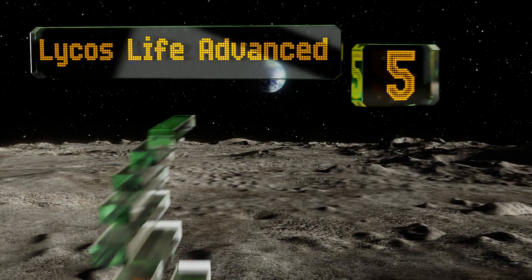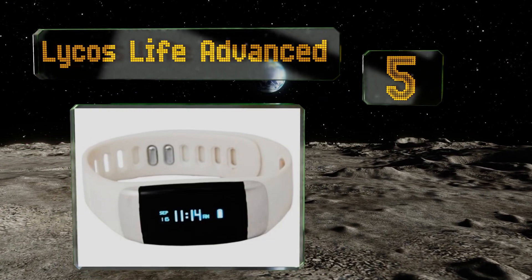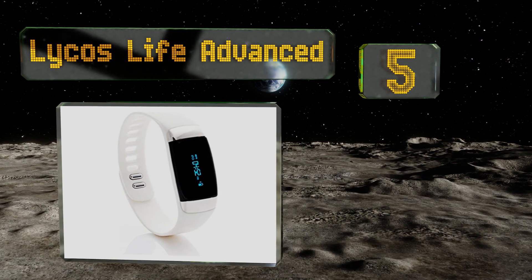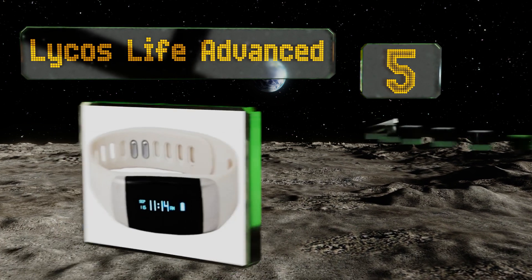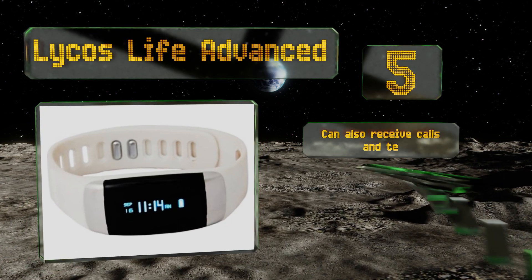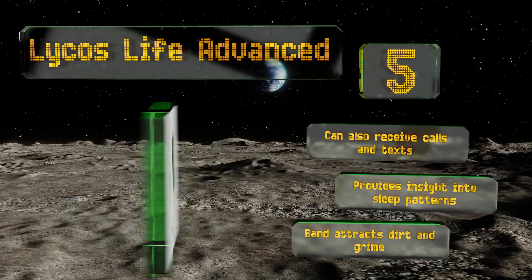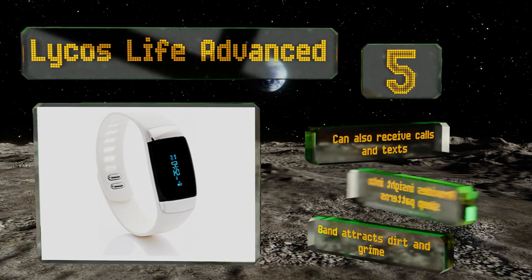At number five, it shouldn't be your only source of information about your vascular health, but the Lycos Life Advance can provide an overview of what's going on inside your chest. The companion app graphs EKG readings, letting you know when it's time for a closer look. It can also receive calls and texts and provides insight into sleep patterns, but the band attracts dirt and grime.